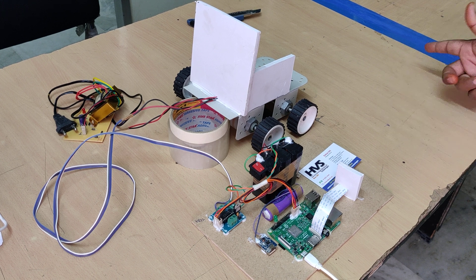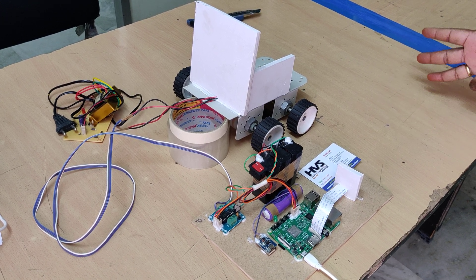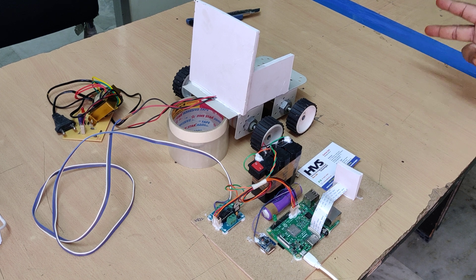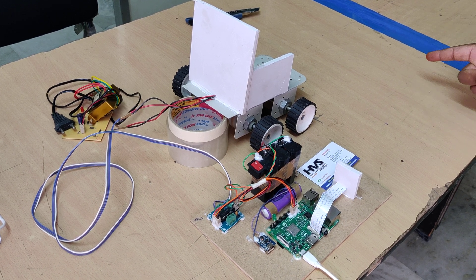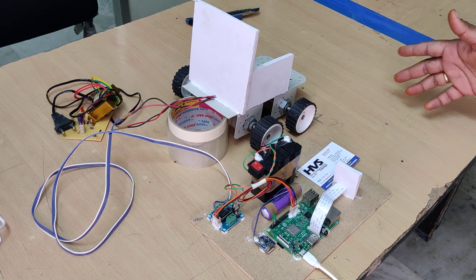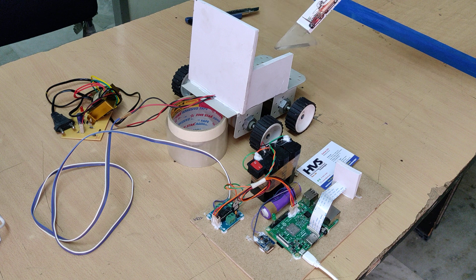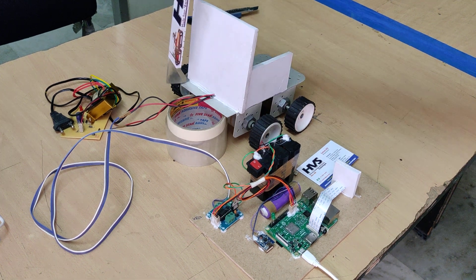We coded the program such that two fingers is forward, three is for left, and four is for right. So two fingers — it will count the fingers on my hand — and based on those instructions we are going to control the wheelchair, which has two DC motors attached.